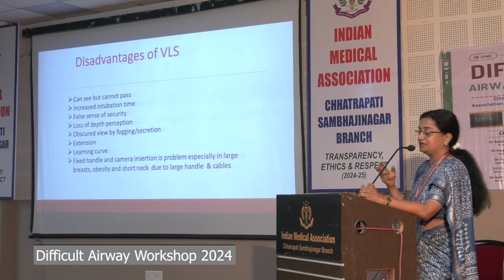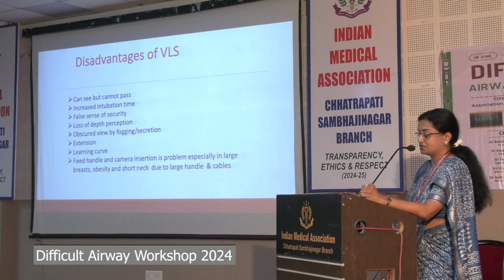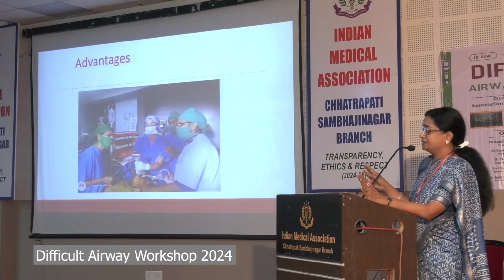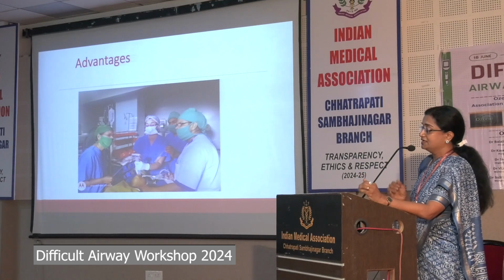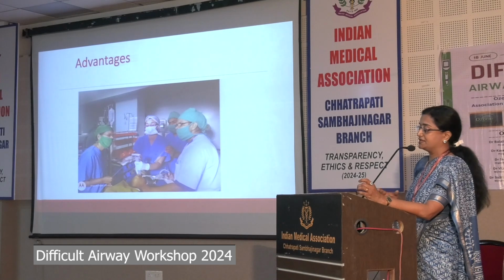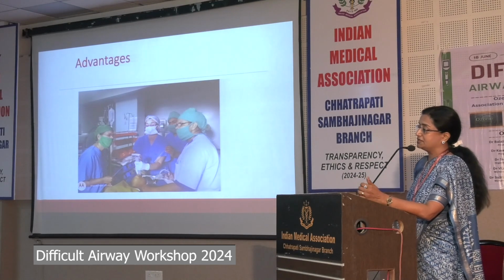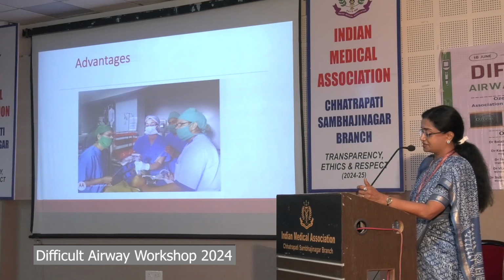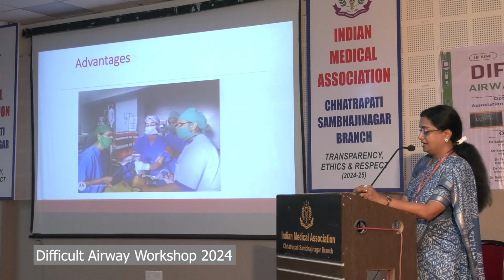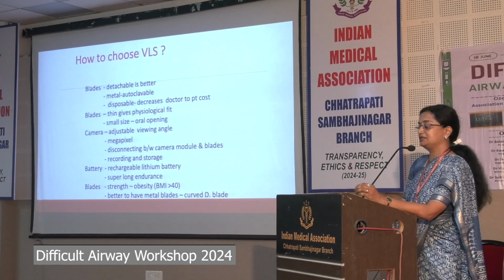A fixed handle or camera insertion is a problem, especially in large breast, obesity or short neck. Advantages you can see here. There is no line of sight. I'm standing straight. Limited mouth opening you can give, and less time is wasted in cricoid pressure. People around you can see, and they can assist you immediately with a bougie, a laryngeal mask, or a suction if needed. It causes less trauma because of less forces needed, and you can also use a video laryngoscope for assessing the patient in the PSC.